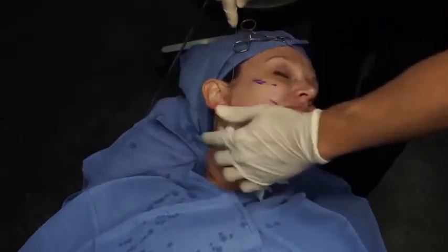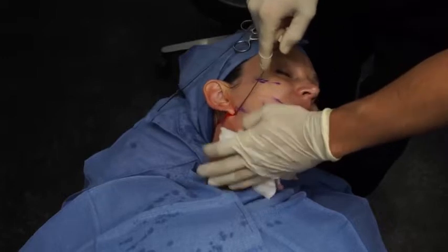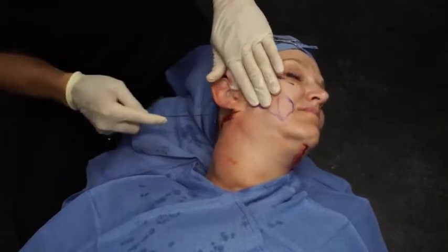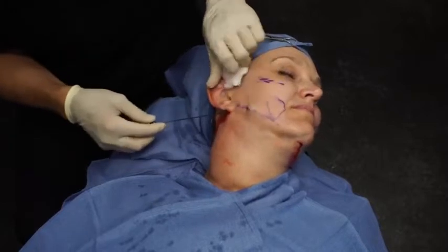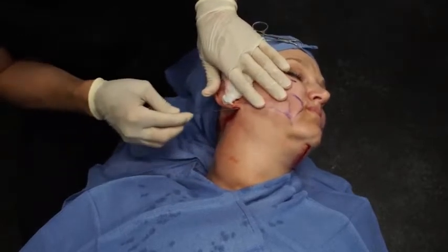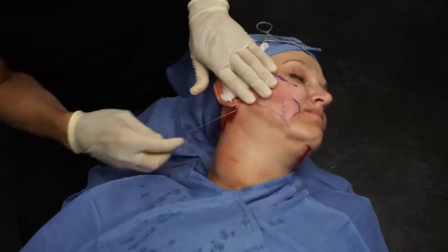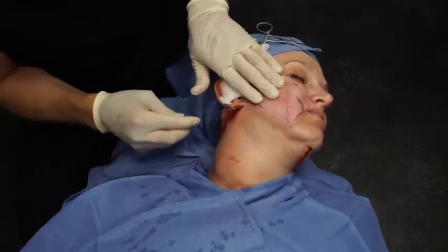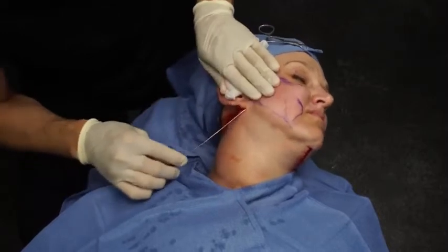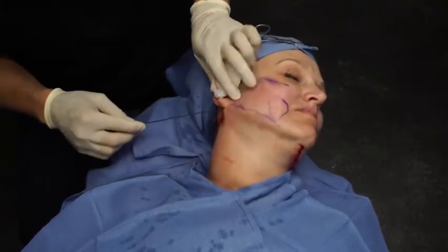Surgeon preference for tumescent is varied. I like a tumescent pump or infiltration pump to allow me to generously, evenly, and easily apply the tumescent in the subdermal plane. And again, we'd use about 250 cc's, and I use these blunt 17 gauge cannulas to allow me to get into the most superficial zone. And here again, I'm infusing the tissue in an anterograde fashion. A little difficulty right there. We'll redirect. You can go as far as you need to, as long as you're staying superficial to avoid any nerve injuries. Turn to the right for me.